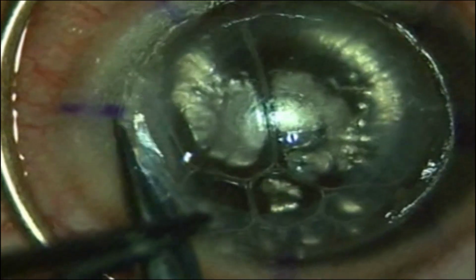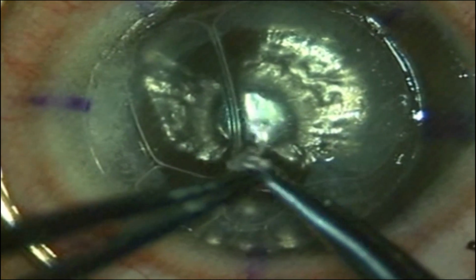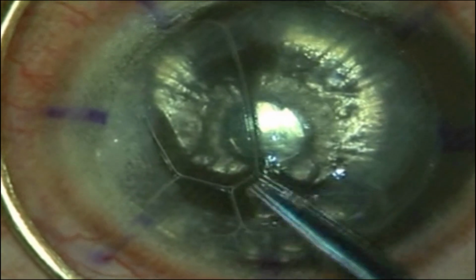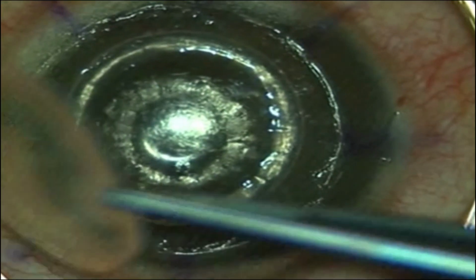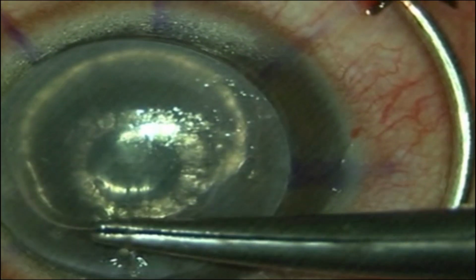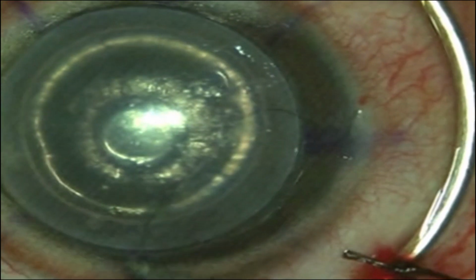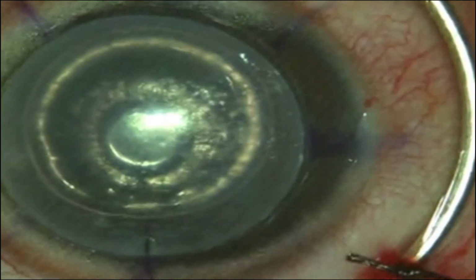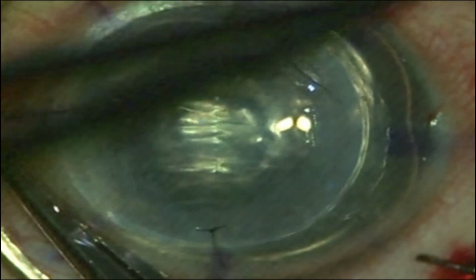After complete baring of the Descemet's membrane, the suture applied to the perforated area was removed along with the residual stroma. A same-size donor graft is applied to the bared Descemet's and sutured. Thus, this case was successfully completed.